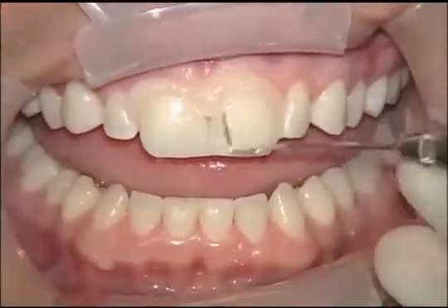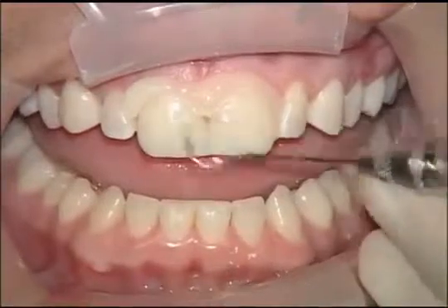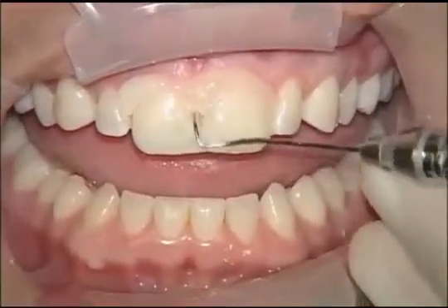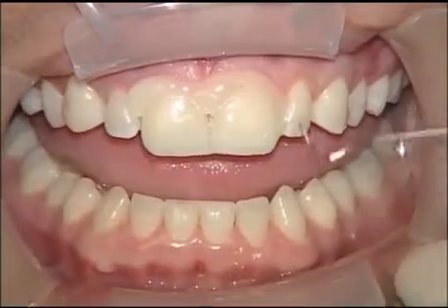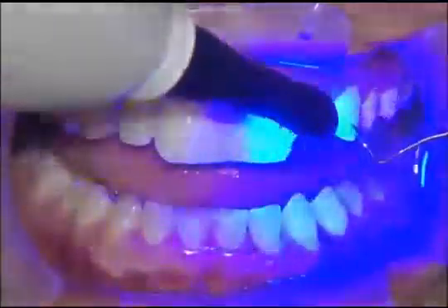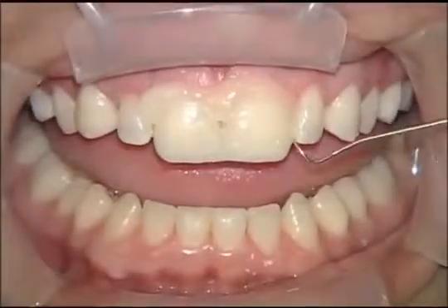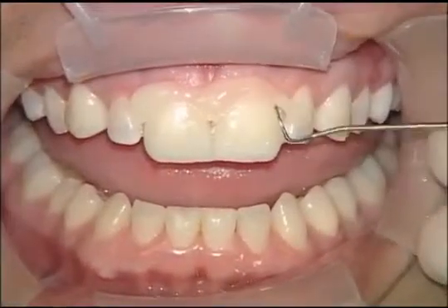And you can see that as I start to work the Explorer under this material, it has gotten to its gel state, which makes it very easy to clean up at this point. The thinner veneer cements tend to run everywhere, and it's a little more difficult to do it. And I can see over here on the distal that it's not quite cured yet, so she's going to give me another 1.5 and 2 seconds, and we're going to see, and that appears to have set it up. So we'll go ahead and be able to remove this in one big piece.